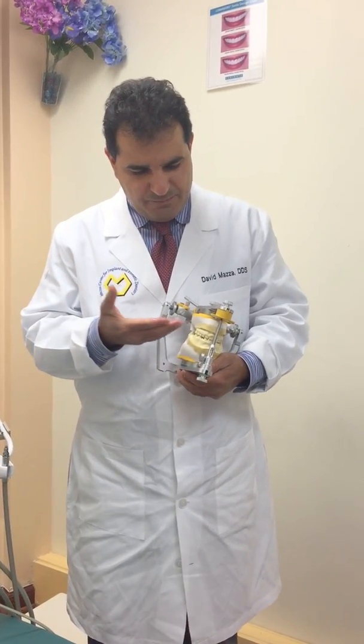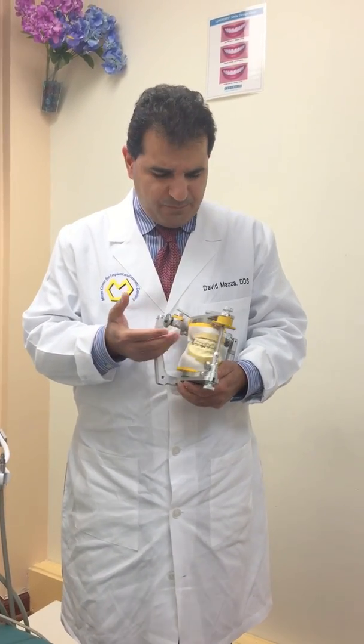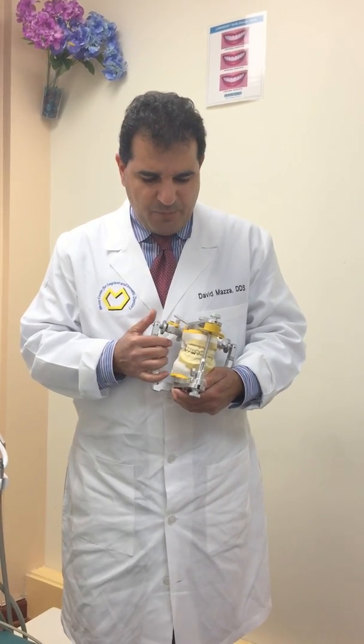We have already mounted our maxillary cast based on an Axioquick earbow transfer from SAM, and we have also mounted the mandibular cast based on maximum intercuspidation bite registration.